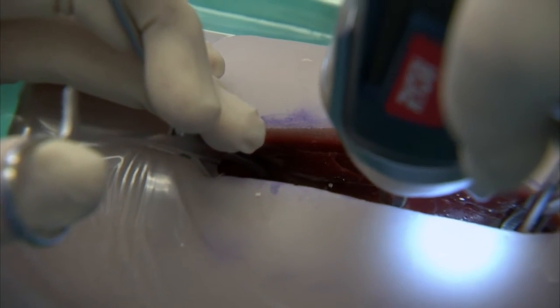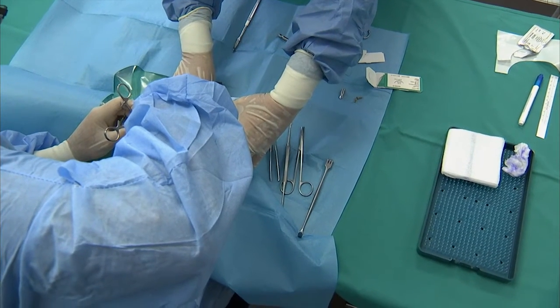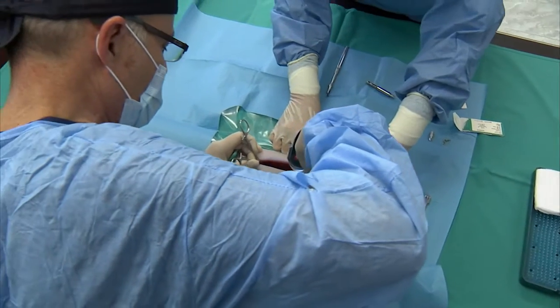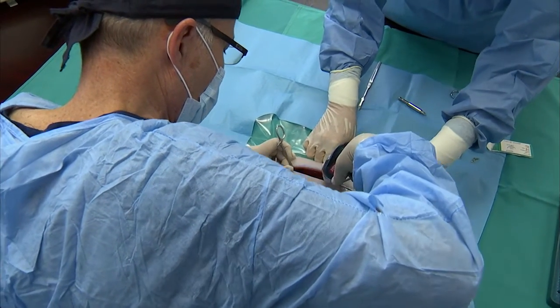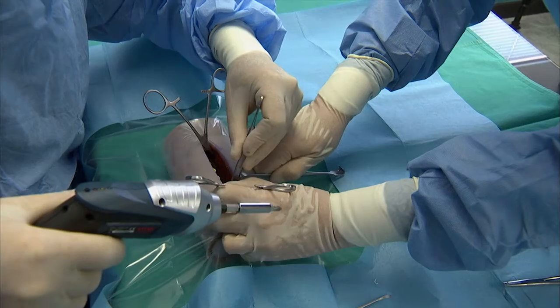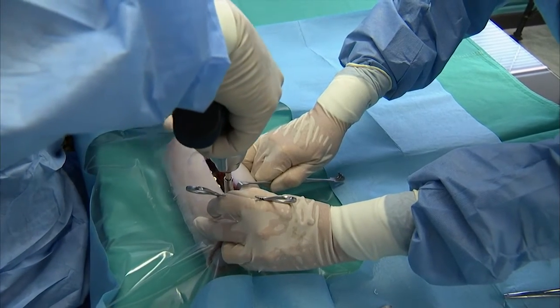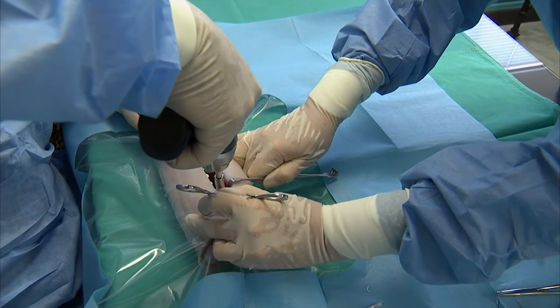Ensure that the drill is rotating forwards or clockwise when drilling. Put the drill in reverse or anti-clockwise to facilitate withdrawal of the drill. Drill at a 90-degree angle to the bone surface. Aim for the middle of the hole in the plate or slightly away from the fracture line. This will ensure a bit of compression when the bone screws are tightened.